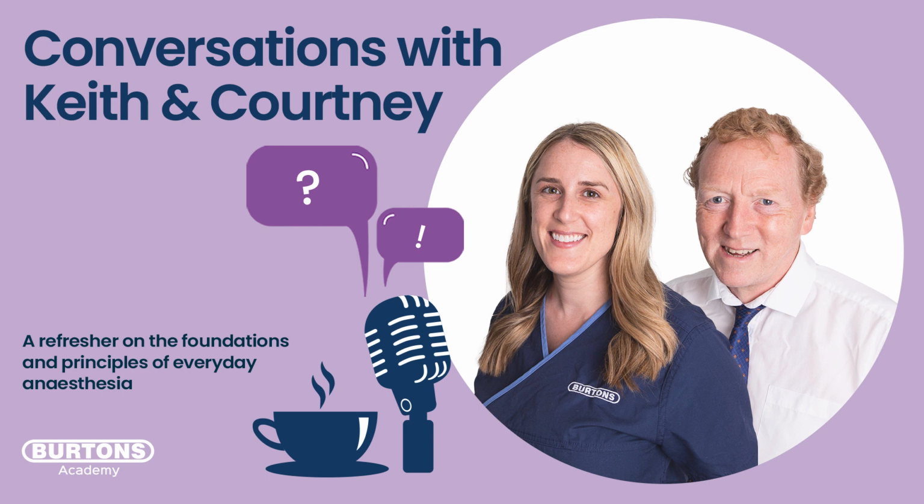That's it. Okay. So now I think, and correct me if I'm wrong, Courtney, but I think someone could walk up to a machine, irrespective of make or model, set a tidal volume, set an inspiratory time, set either an expiratory time or respiratory rate, and then the last thing, so there are 2 things we need further to consider, is pressure. Mm-hmm. And you're not setting a pressure, you're just setting or possibly setting a maximum pressure that you'd like the animal never to go above. Kind of our safety, isn't it? Our safety valve, exactly, yeah.